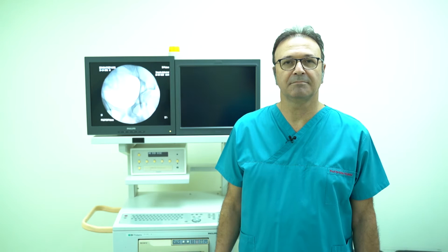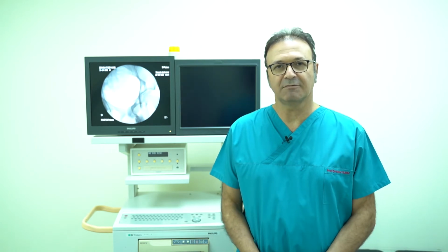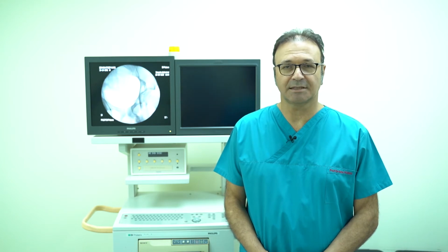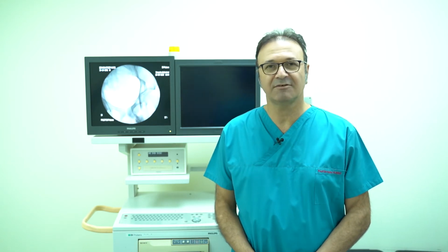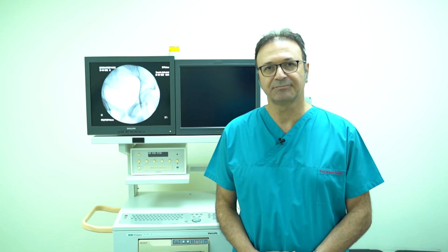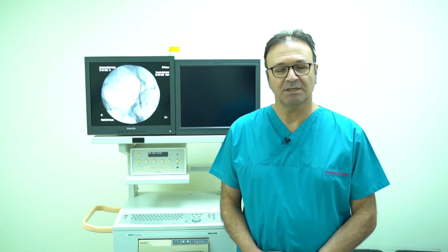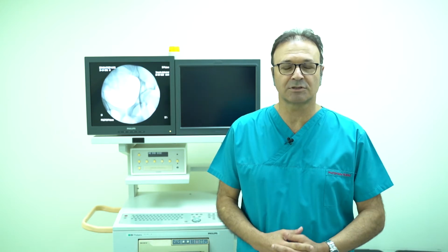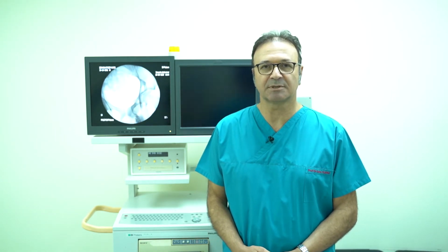Embolization is a minimally invasive treatment option in varicocele. It is done under local anesthesia when the patient is awake with mild sedation. We use standard angiography or some C-arm fluoroscopy machines for this procedure.